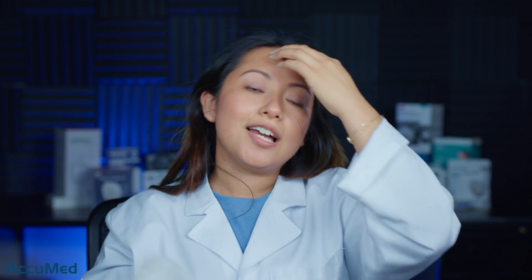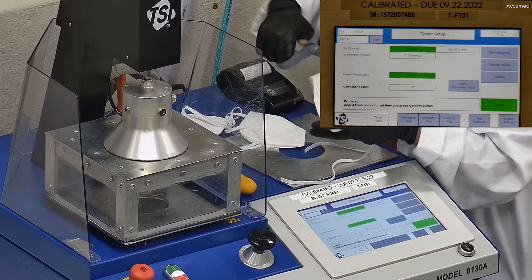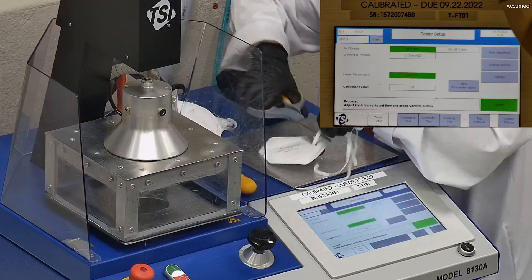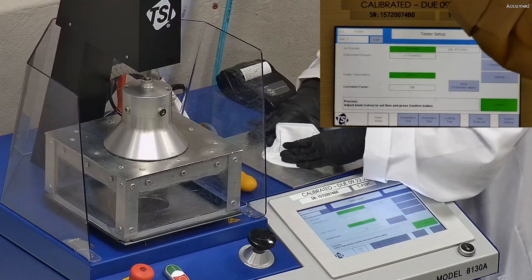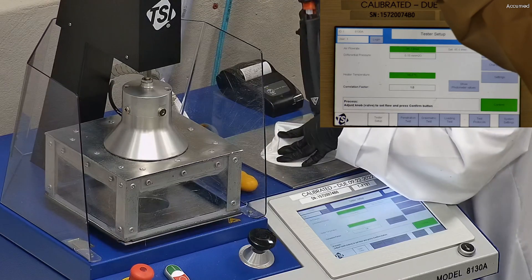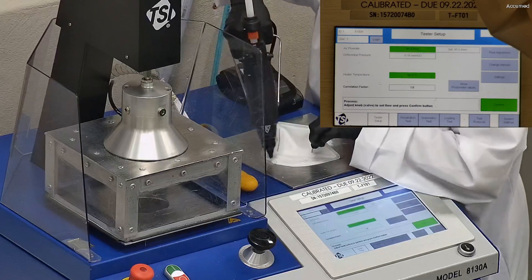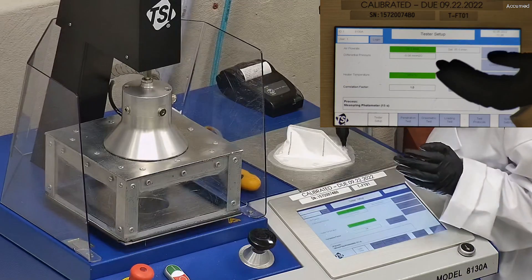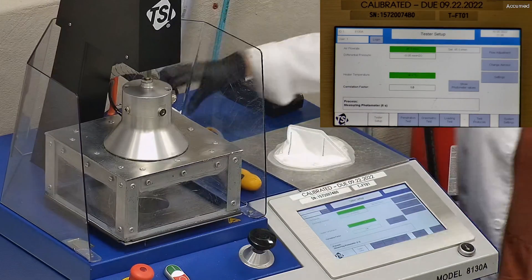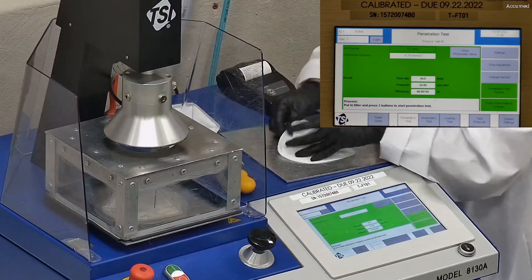Let's go ahead and see how they test on our TSI machine. We're going to be testing both the filtration and the breathability. This is our TSI machine model 8130A, which is the same filtration testing machine that NIOSH uses to approve N95 respirators. Our procedure is also inspired by NIOSH. We first run the tester setup and start removing the headband from the respirator before placing it onto the testing plate. We make sure that the respirator is properly and completely sealed with hot glue to the testing plate, ensuring there are no holes or leakage around the seal to ensure accurate results.